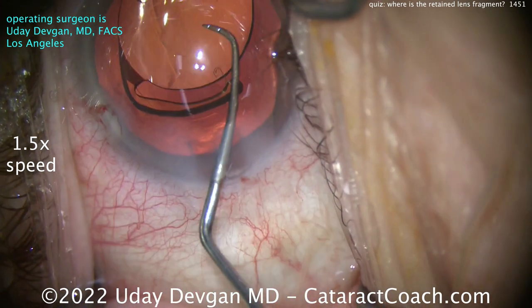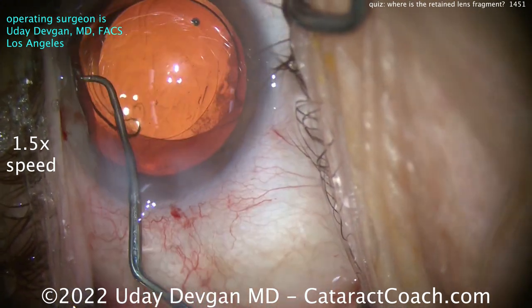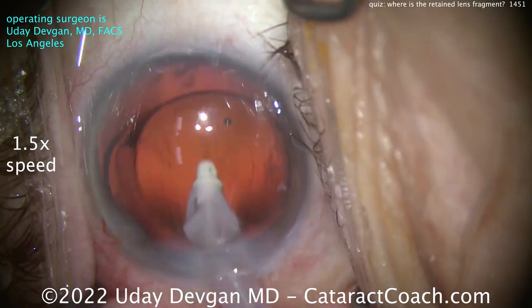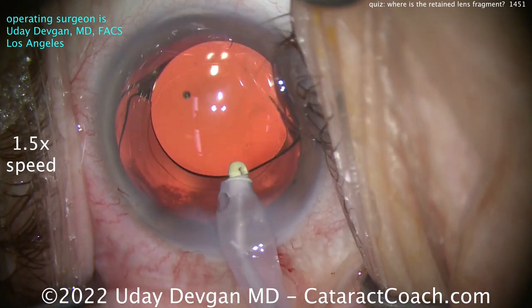There's a little tiny piece — I see something near the lens or within the optic. We'll get that out. Lens is centered up, I think it's a reasonable-looking rhexis. I/A probe going inside to remove the viscoelastic. Flow is now 60 cc's a minute.